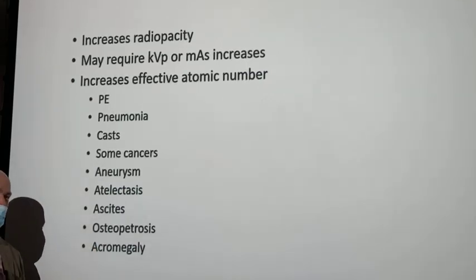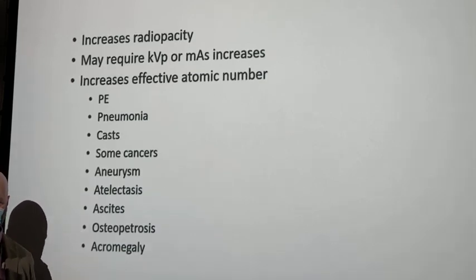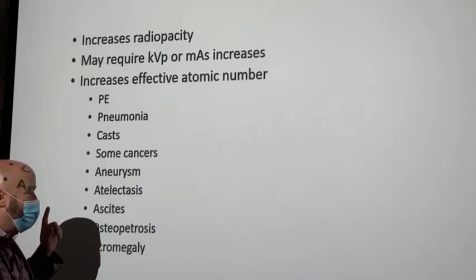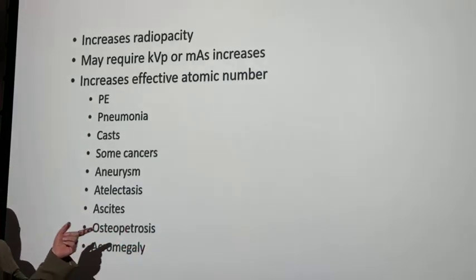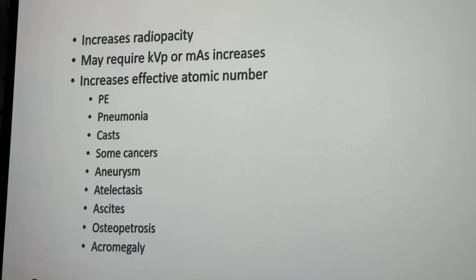Osteopetrosis is kind of like the opposite of osteoporosis. All right? Now we've got an addition of bone. So if our bone gets significantly more dense, what's that going to look like on the image?